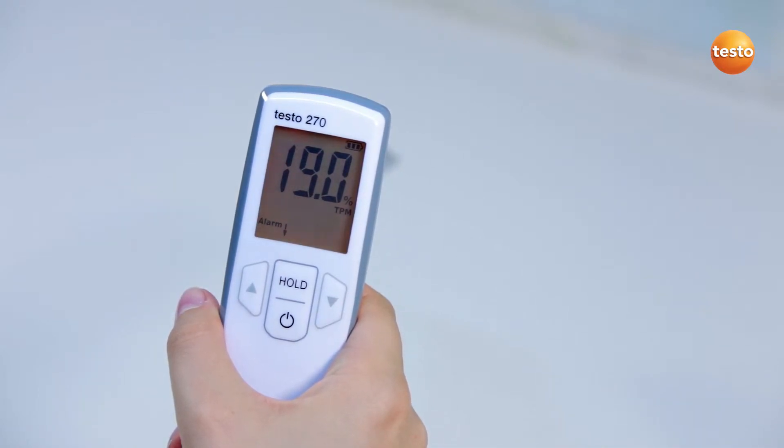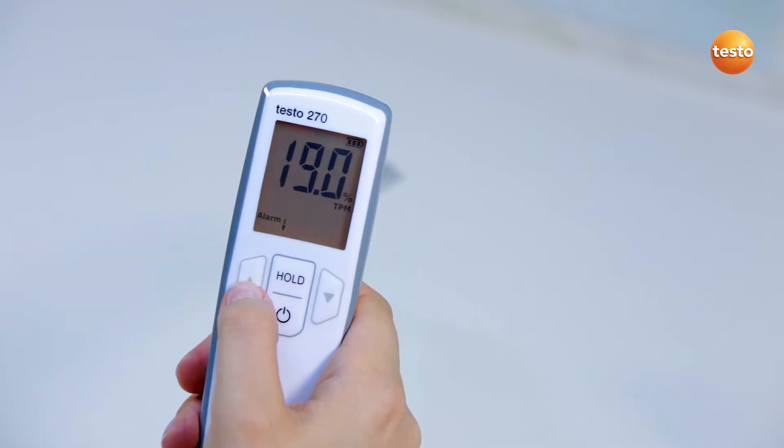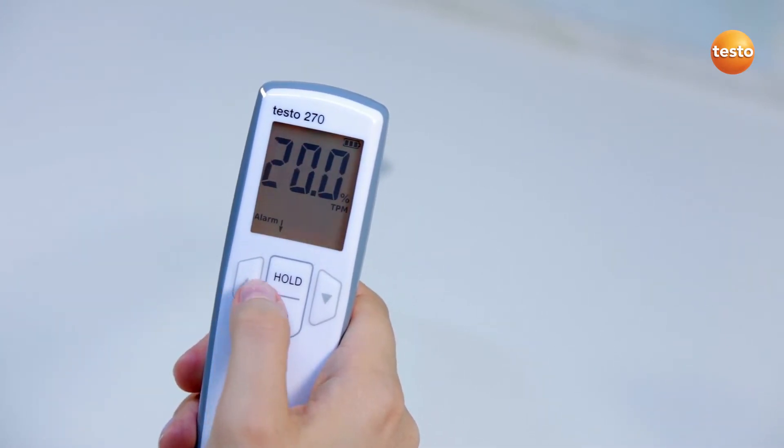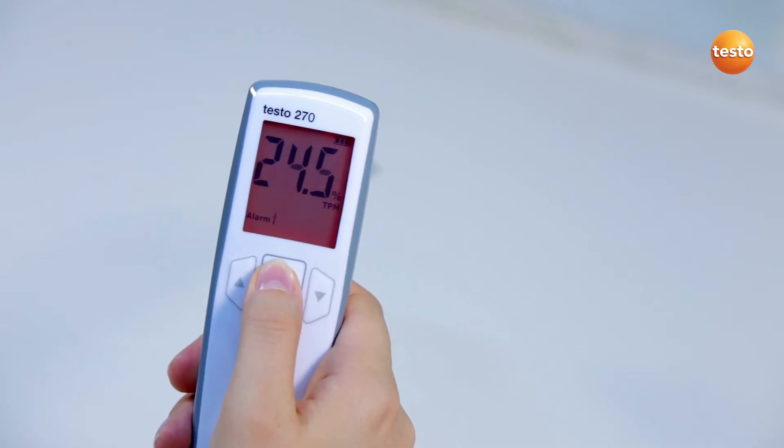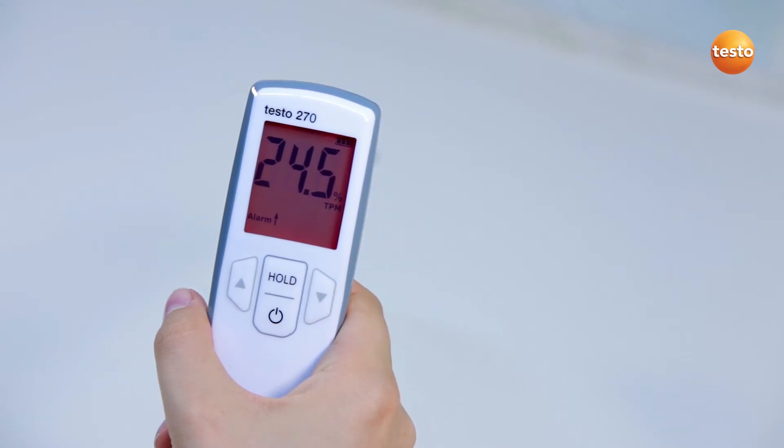In the first menu item, I can define my TPM limit values. With the arrow buttons, I change the lower limit value and confirm with the hold button. Then comes the upper limit value, which I also set using the arrow buttons.